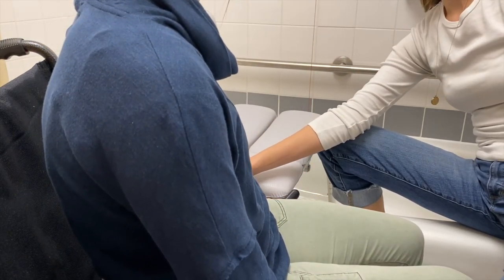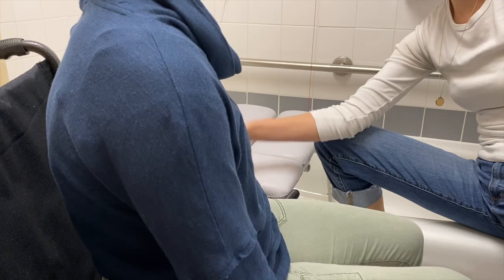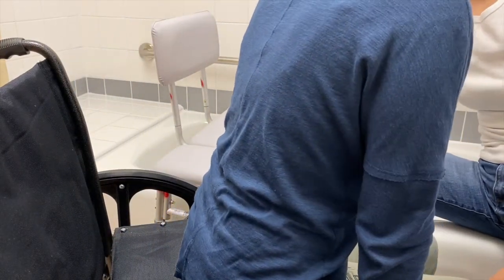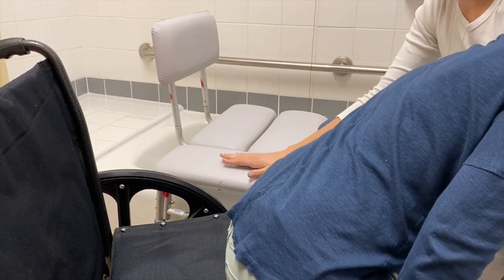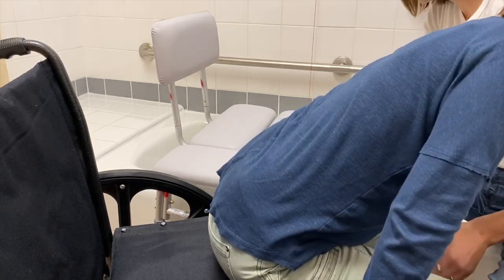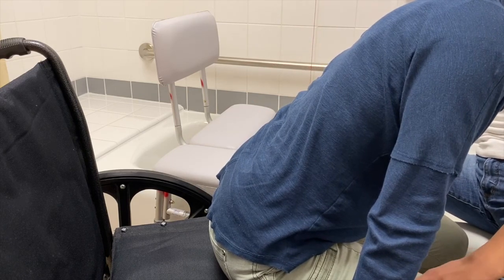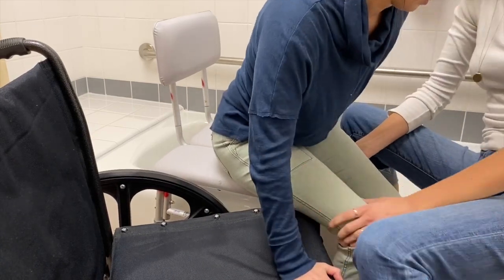Standard breezy chairs that people often have in hospitals have solid rubber wheels, so there's not a lot of tread to take off skin, but it can still cause a lot of skin damage or bruising. So you want to make sure that when they scoot forward, their butt is going to clear where that wheel is. She's coming over my side here, aiming to get her butt onto the pad. I'll have her do a little half transfer to get to the edge of the chair. Then I'll readjust her feet so she doesn't get caught on the wheel, angle her toes so they'll be aligned properly when she moves over — we don't want to put a lot of torque on the knee. Then I'll cue her to push up and slide her hand close to her butt, up and over.